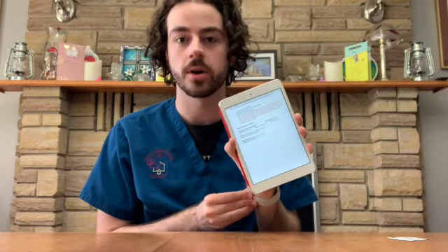Upon walking into my patient's room, I'm going to introduce myself and compare their wristband to the information I have on the MAR, asking my patient identifiers to ensure that I have the right patient. Before that, I'm actually going to look at the medication order. My printer is broken, unfortunately, so I just have it on here. The order is for heparin, 5,000 units subcutaneous, and our supply is 5,000 units per 1 milliliter vial. So I'm going to be drawing up 1 milliliter of medication.